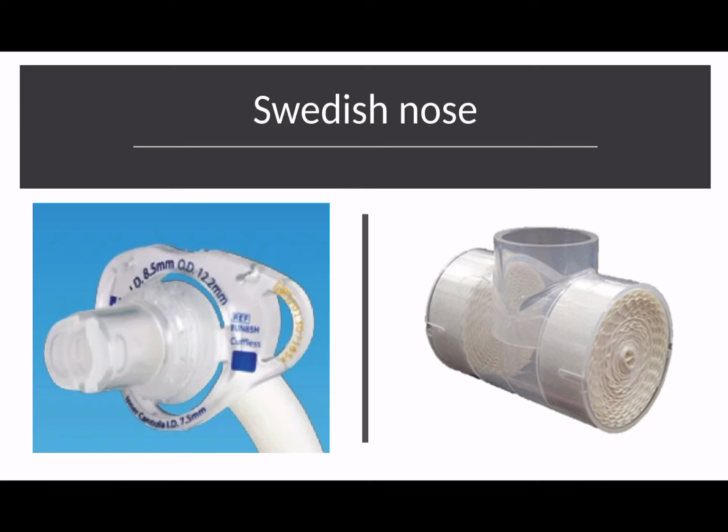The reason it's called Swedish is because it was developed in Sweden, and nose is because it's effectively doing what the nose is doing, i.e. humidifying and heating up the air that the patient's breathing in through their tracheostomy. As such, they stick it onto the end of the tracheostomy, and so they can breathe in and out.